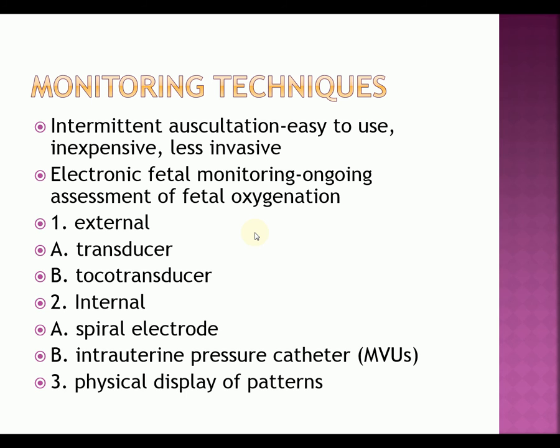You've heard me say external, internal, intrauterine pressure catheter. So let's talk about these for a little bit. Your external monitoring is where the device is. You can either do external with the electronic.